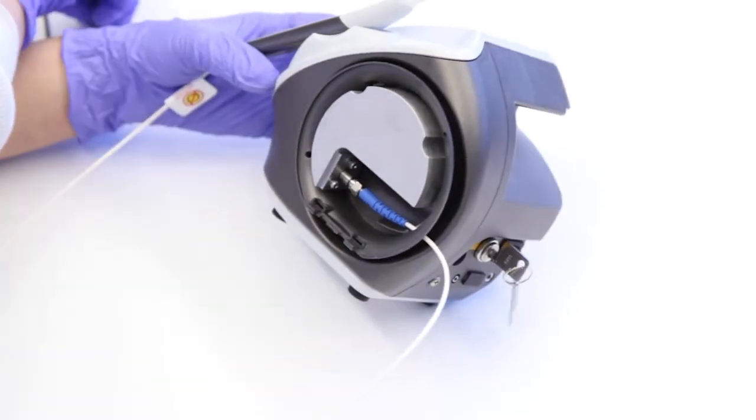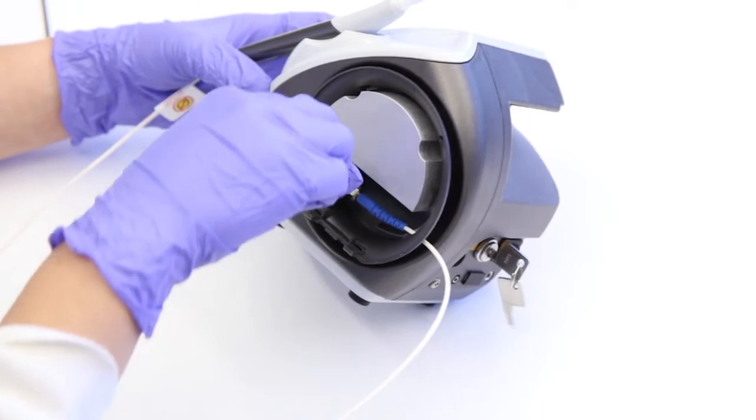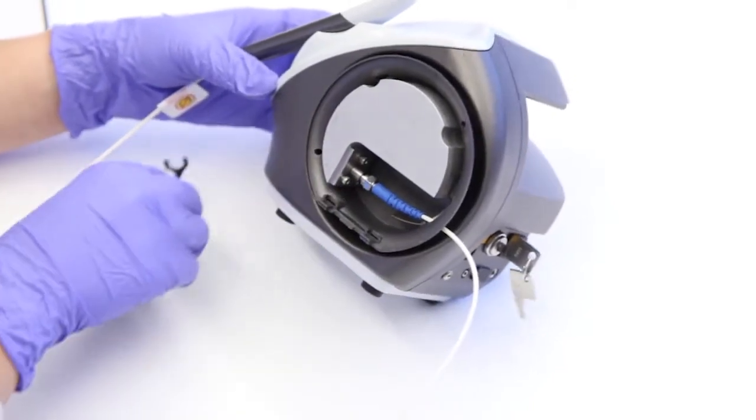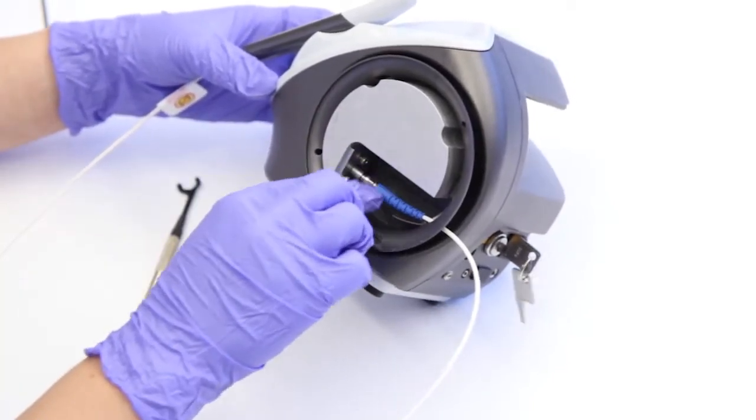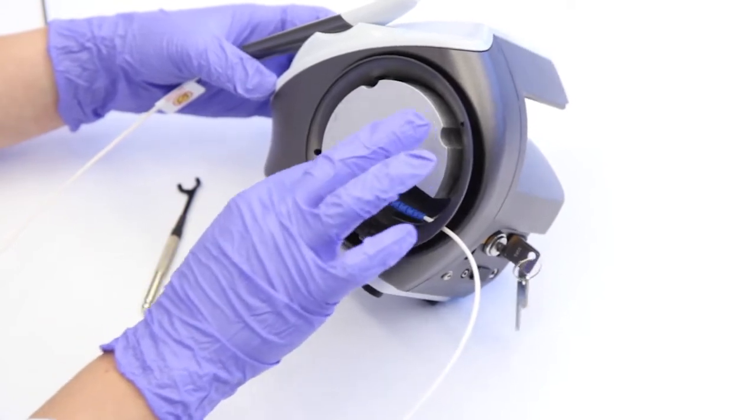Take the wrench and place it on the SMA connector and unscrew with one turn of the wrench to loosen. Then, use your fingers to continue unscrewing the connector from the diode aperture.